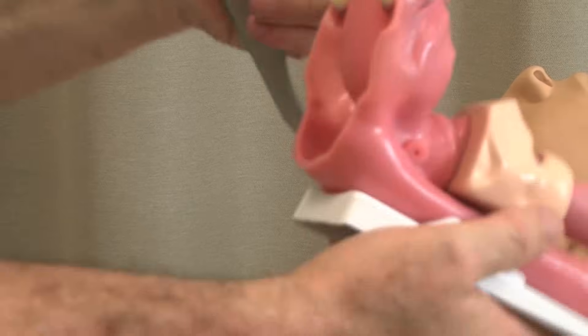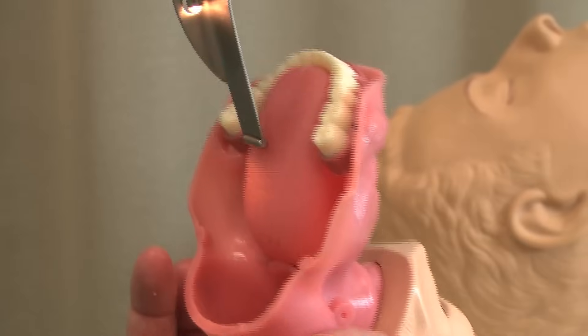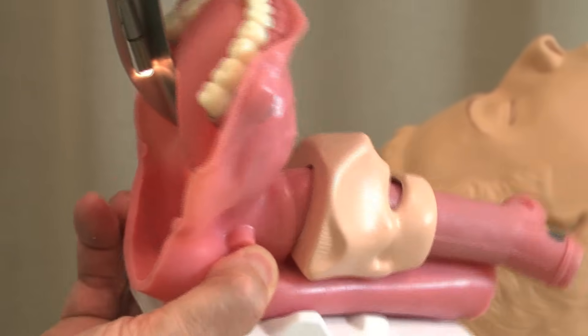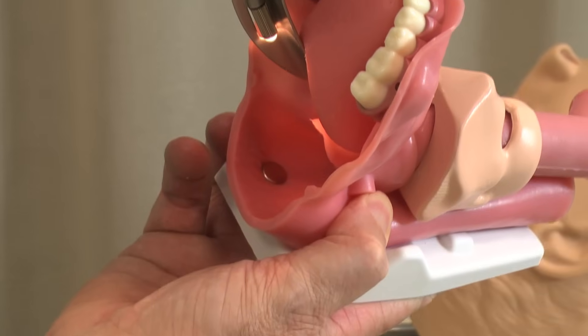A mistake so many people make — I'll show you the close-up here — is they really don't get to the side. They sort of stay in the middle. And then when they try to look, the tongue will just kind of slide over. The tongue is very wet, and it will slide over and now you're not getting much of a view at all.